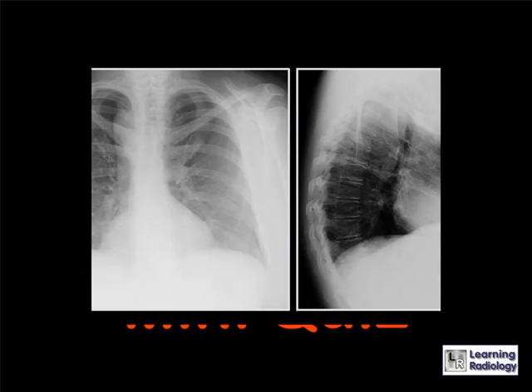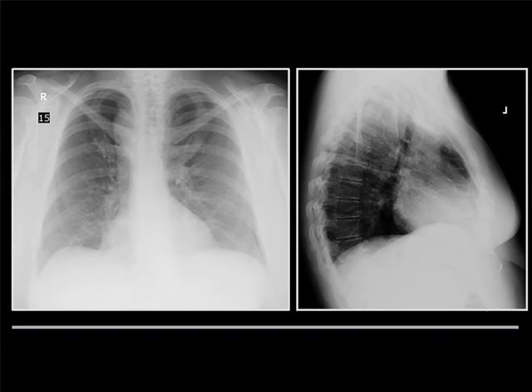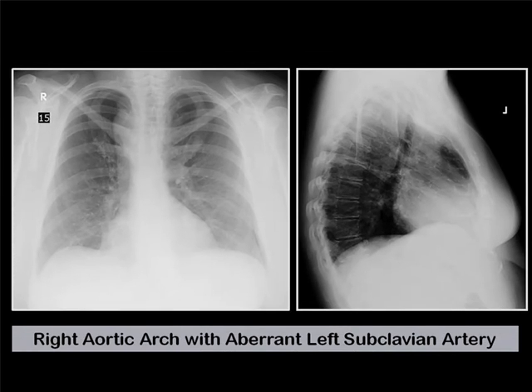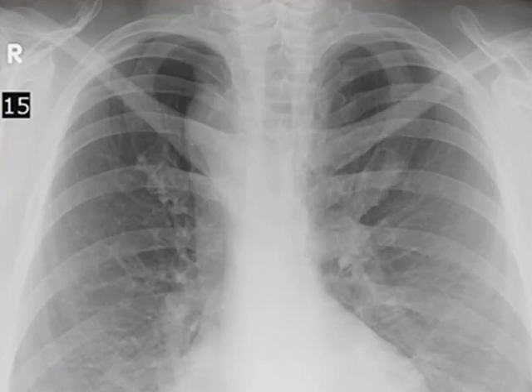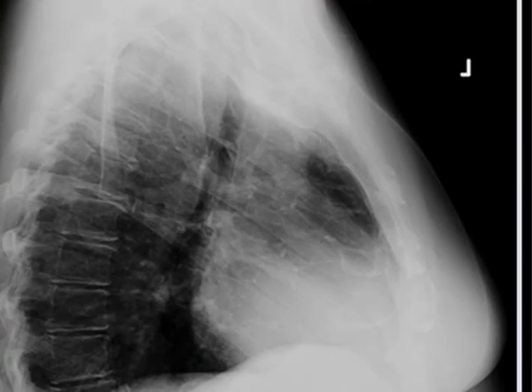Here is your mini-quiz. This is an adult — you have a frontal and lateral chest x-ray. Pause your player and decide what you think. If you said this is a right aortic arch with an aberrant left subclavian artery, you'd be correct. This image shows the right aortic arch displacing the air-filled trachea to the left, and the lateral image demonstrates forward displacement of the air-filled trachea, indicating that there is an aberrant vessel behind.